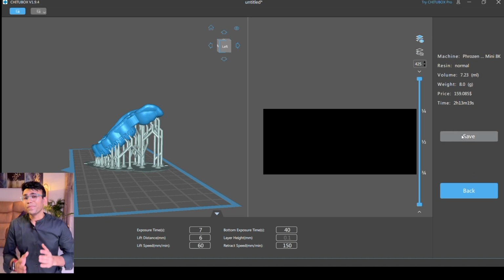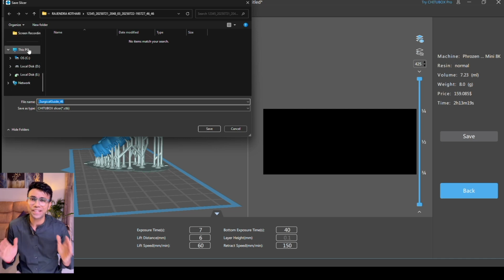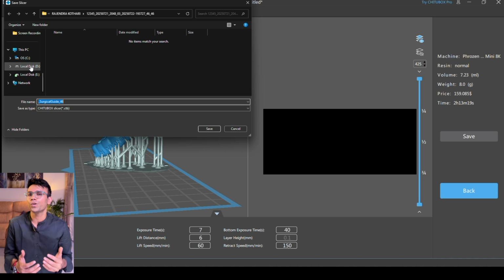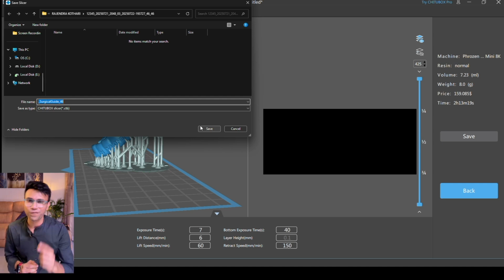Simple, right? Now that you have seen how doable in-clinic surgical guide printing really is, imagine what it could do for your implant workflow. If you're excited to bring this into your own practice but don't know where to start, we are working on something just for you.